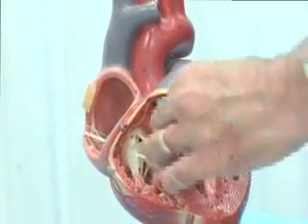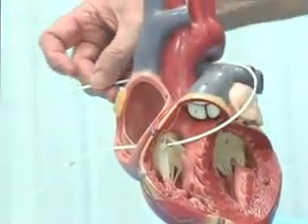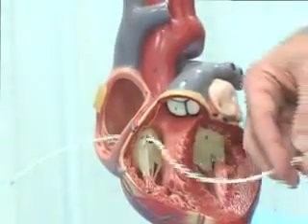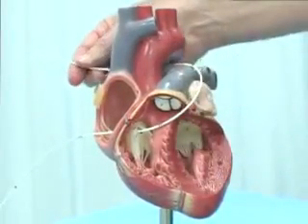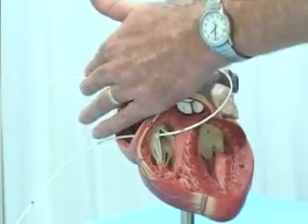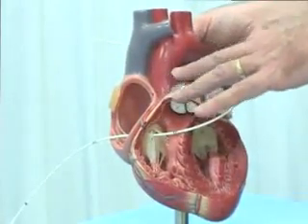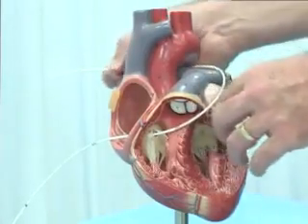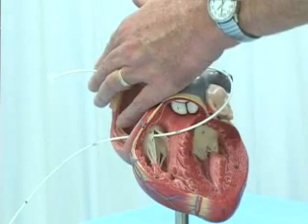A couple of dangerous complications: if you leave the balloon inflated, you've occluded the pulmonary artery vessel and can cause a pulmonary infarct. The most dreaded complication — and one I've seen a few times — is PA rupture. If the catheter goes far enough out into a tiny vessel and you inflate the balloon at the wrong time, it can tear apart that vessel. The pulmonary vasculature is very thin, not used to high pressures — almost like a vein, nothing like the aorta. Inflate in one of those thin little vessels and suddenly the trachea or endotracheal tube fills with bright blood.